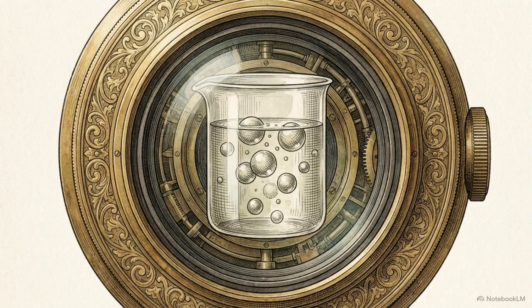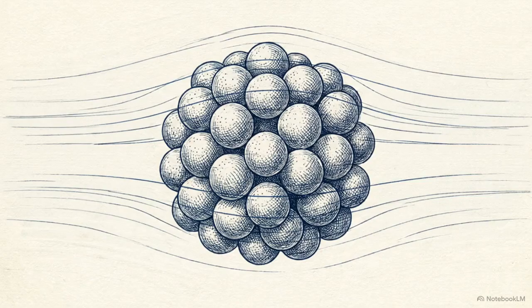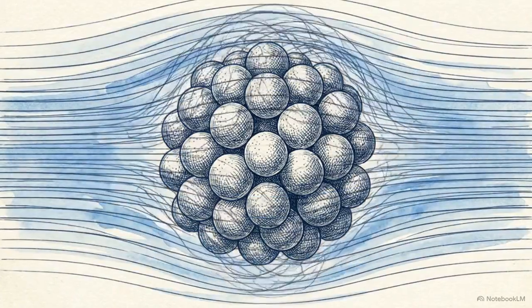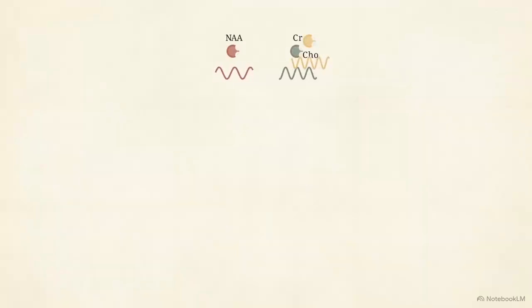We are repurposing an anatomical camera to act as a highly localized biochemical assay. Protons existing in different molecular environments experience microscopic variations in their local magnetic field. Because that local magnetic field changes, the Larmor frequency of those specific protons also shifts by a tiny margin. Isolating molecules reveals their proton groups each emit a distinct frequency wave.